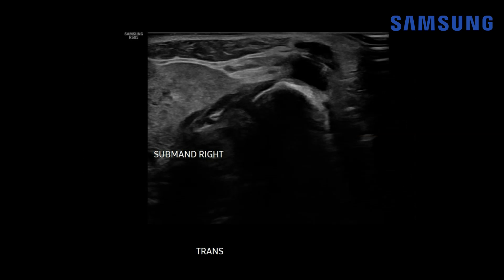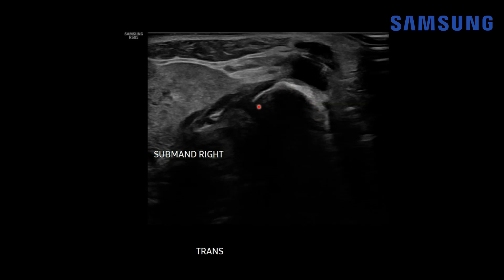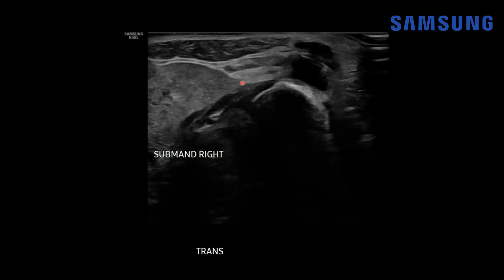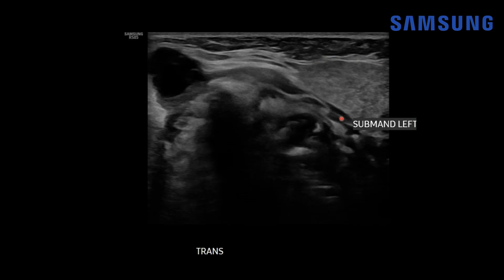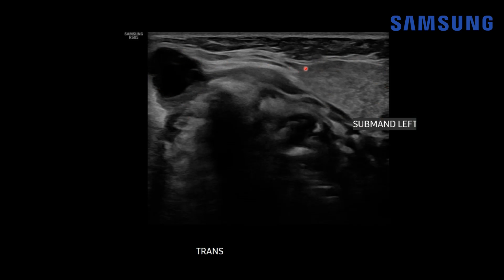It's also important to document where the structure is relative to the salivary glands. Here's the echogenic hyoid bone, and at the same level the submandibular glands occur. There's the right submandibular gland, and here's the thyroglossal duct cyst — notice that it's separate from that. And the same on this left transverse view: there's the left submandibular gland with the thyroglossal duct cyst here. Notice that there's separation.